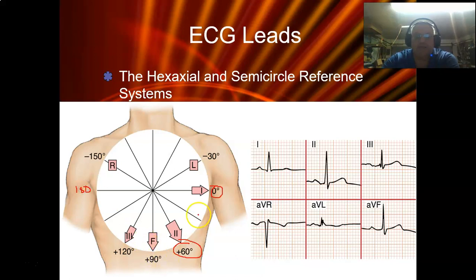Now, this is where everything gets kind of funny. There are certain systems that do minus 90, and you might also see them out there that say 270. And this one, I will tell you, is kind of manufacturer based. So if you see these numbers, don't freak out about that. Basically, that's how they determine axis. Now the good news is, for some reason they always do 0 to minus 90 on this particular one, so they may go up to 270. Most of the time, it's 0, 90, 180, minus 90.